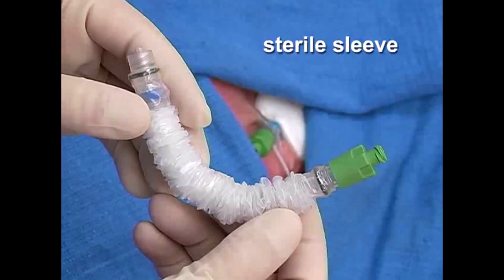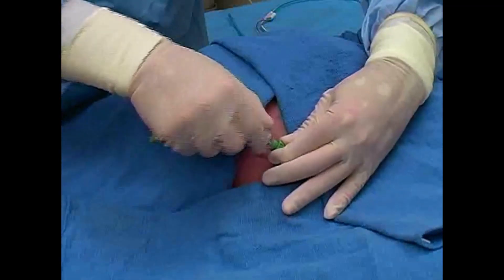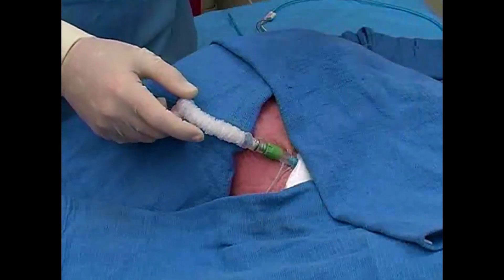Begin the procedure by attaching the sterile sleeve to the hub of the sheath introducer. Specific devices and connections will vary by manufacturer, so you should be familiar with the equipment available at your institution.